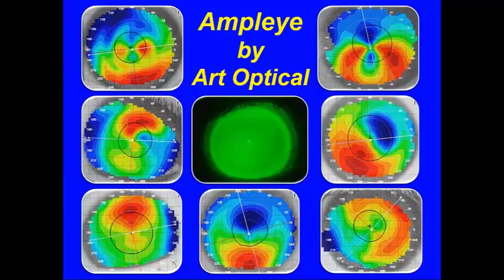Beautiful. Okay, here's another question. This is an attendee that actually has steeper K, so I'm just going to rephrase this slightly. The K range is 47 diopters, and they tried on the trial lens using the normal, which was probably the 4000 sag, and had central touch. So would somebody in the 47 diopter range require a steeper sag right away to begin with, or would we still start with the 4000 if it's a normal cornea?